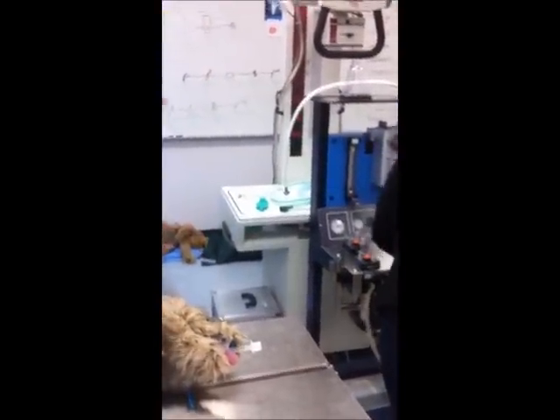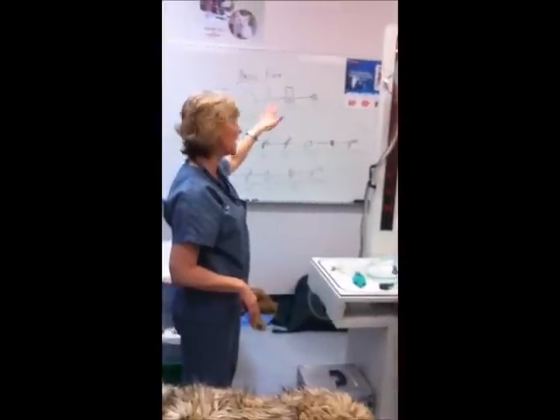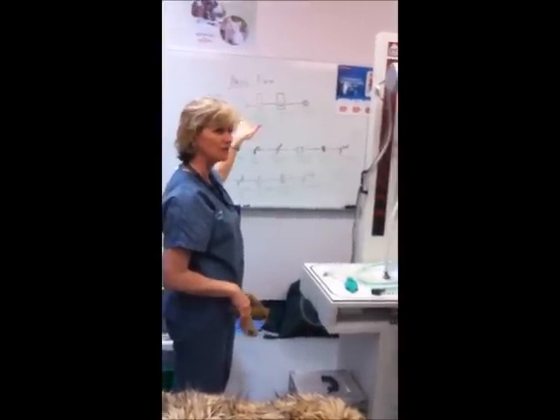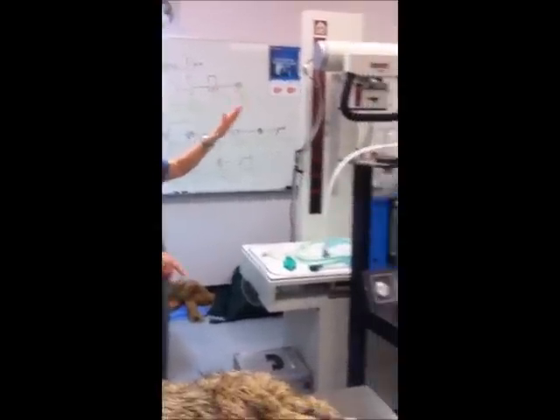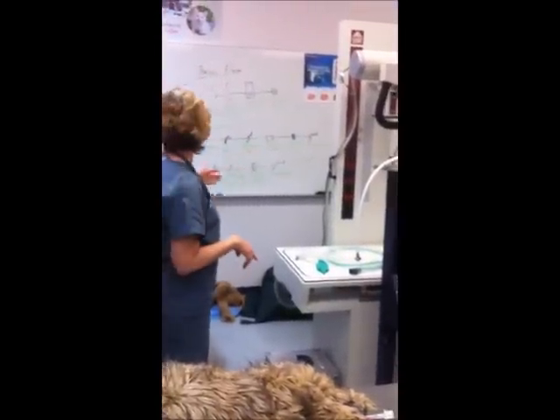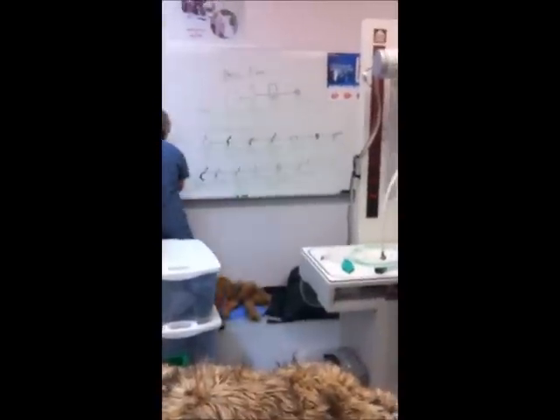Now, on the back here, we've actually done a schematic of the flow. I've had a couple students ask for that. Oh, Terry, you were one of them, okay? So that basically shows one to the next, to the next, to the next. If that helps you to learn, you've got that there for both systems. So, see, I didn't finish. This is your non-rebreathing system.